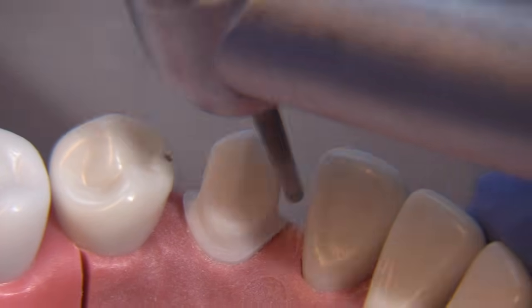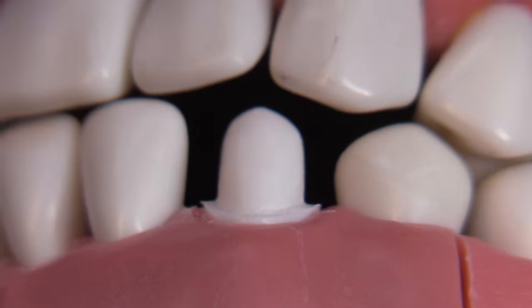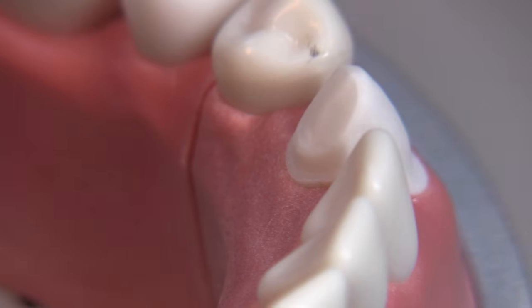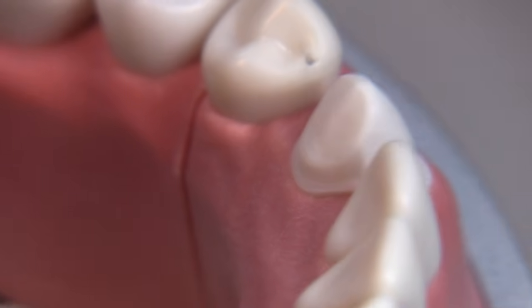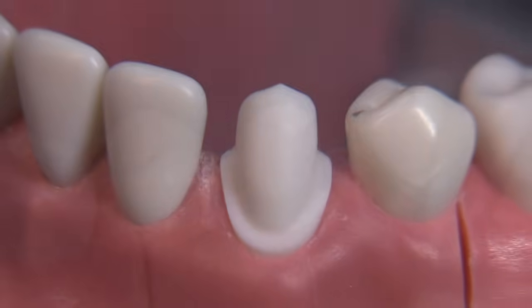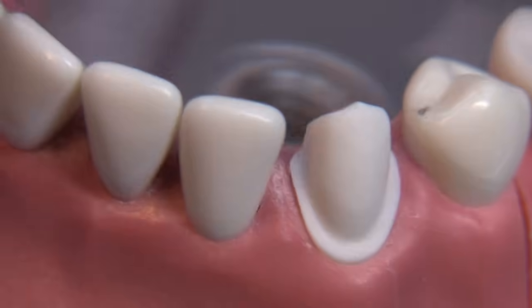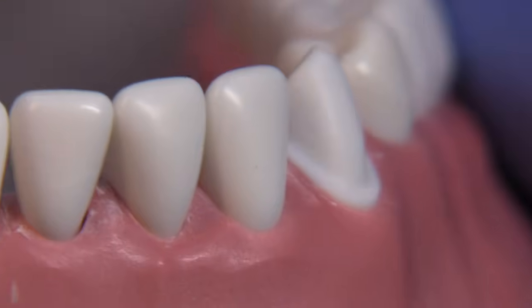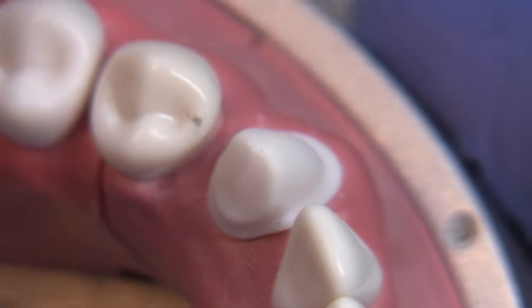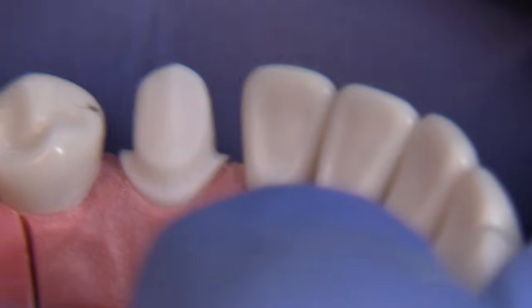The prep is just about completed. Let's take a look at it from the facial view, and then from the side view and lingual — it turned out okay. It's a tricky little prep but one that works quite well when you use the technique described. Thanks for your time and attention; I appreciate all your feedback. I've got a lot of videos to make, so be patient — I want to make everybody happy, and they're a lot of fun to do. Have a great day everybody, take care!